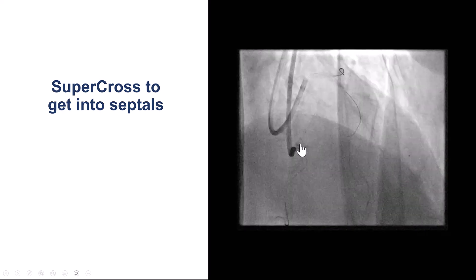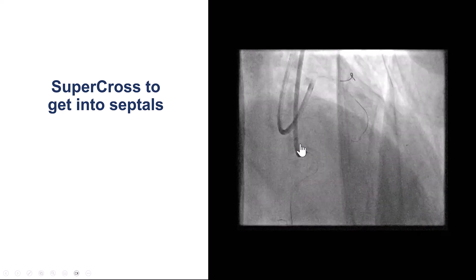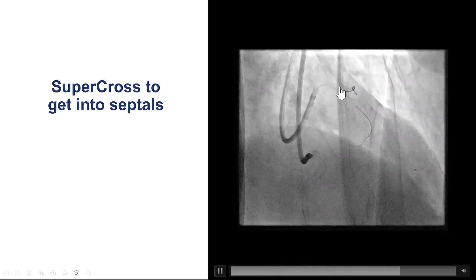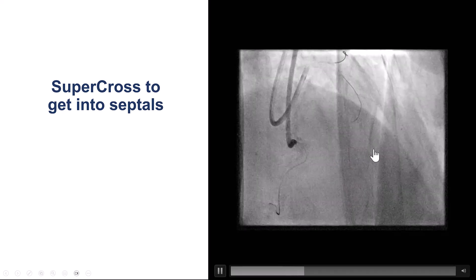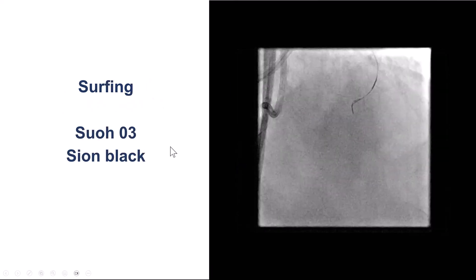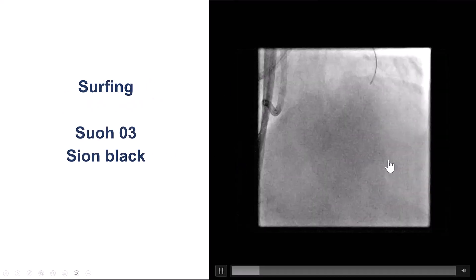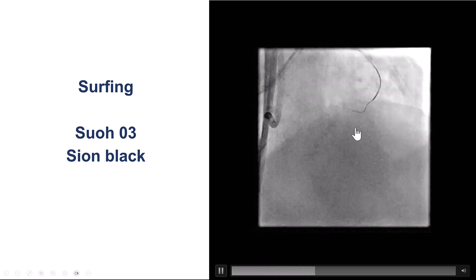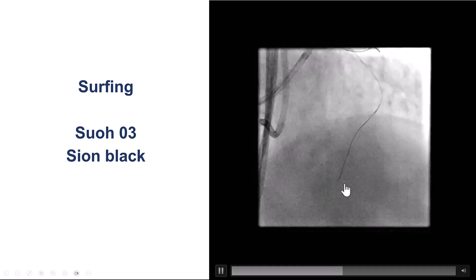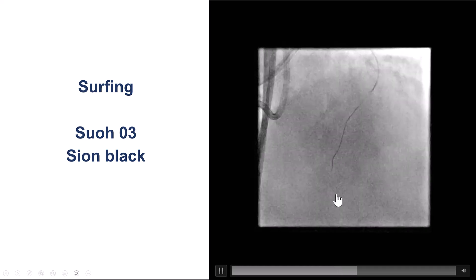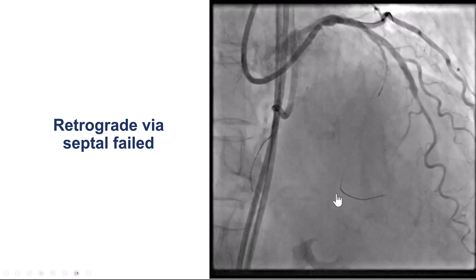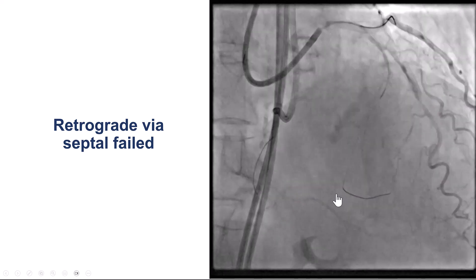After several attempts, we switched to retrograde. We encountered difficulty getting the wire into the septal despite different bends, so we used a Supercross 120, and then there was surfing using the Suoh 03 as well as the Sion Black. However, despite multiple attempts, the wire could not cross into the distal RCA.